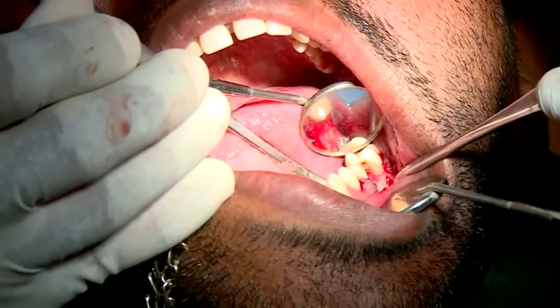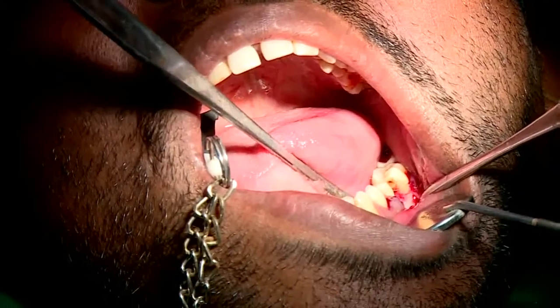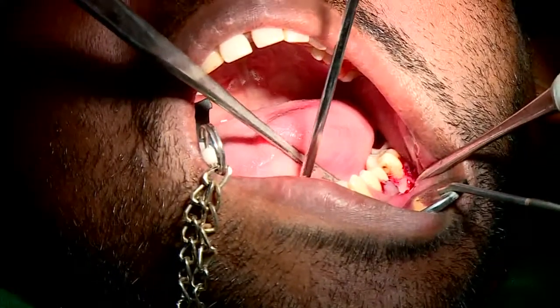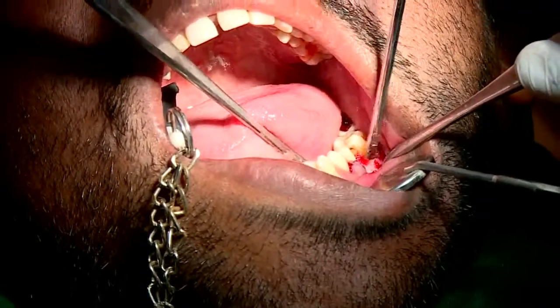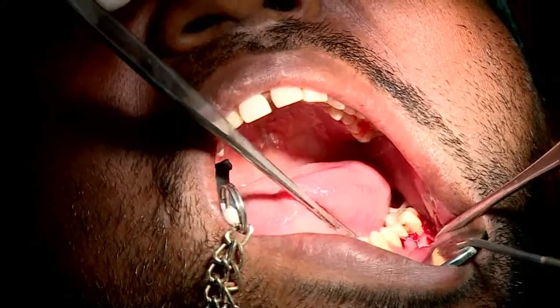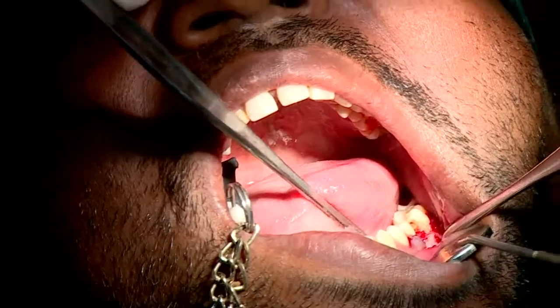Yeah, fine, sir. Now, we talk about a lot of different types of implant placements. We talk about immediate placement, which means we take out the teeth and place an implant. Would I advise that type of implant placement for a beginner? I don't think so. You shouldn't attempt those for the first probably 50 to 100 cases of implants. Immediate implant is a different kettle of fish.